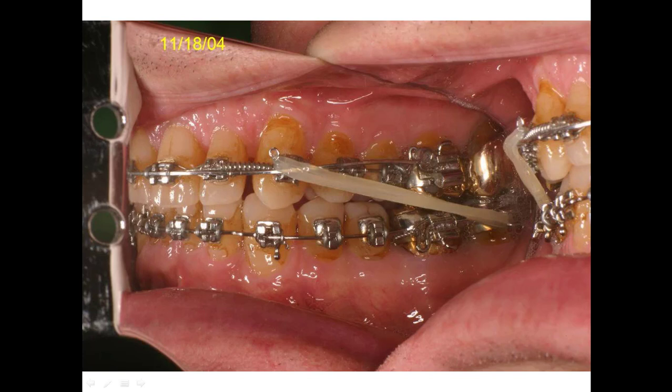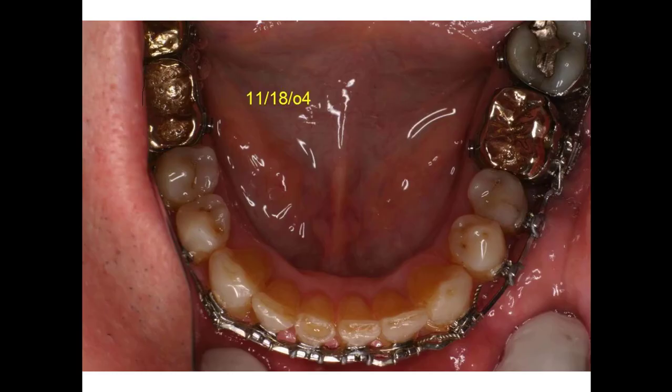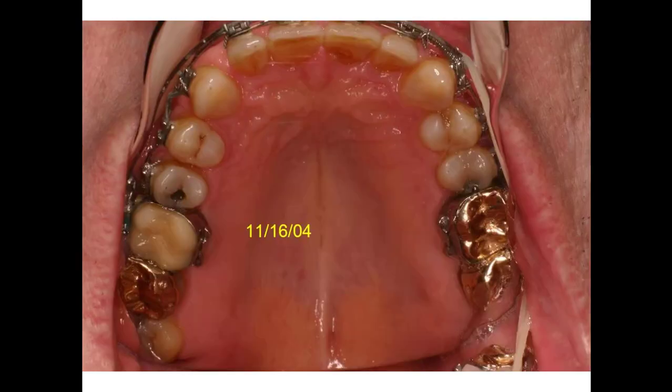The other intruding wire is still on there - you can just barely see it, piggybacked right over the top of the other one. On the other side we didn't need the class two elastic but the intruding wire is still in there. The bottom is pretty well closed up and the top looks better. These two teeth need composite buildup on the sides because the points are in the right place but they need to be a little bigger - especially this one right here. These laterals are too small to fill the gap properly.